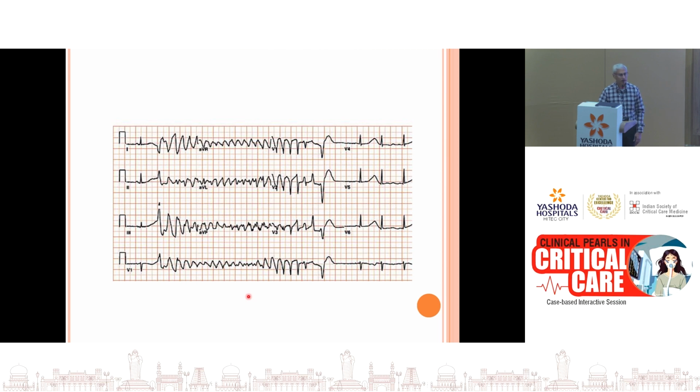There's another example of a tachycardia. Can anybody say what this arrhythmia is? You tell me, is it VF? So this is what we call a polymorphic ventricular tachycardia. Obviously, you can see that the first beat is a sinus beat. This is followed by a rapid series of wide complex beats at a very fast heart rate. And this is obviously ventricular tachycardia.